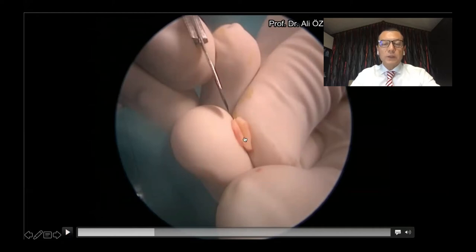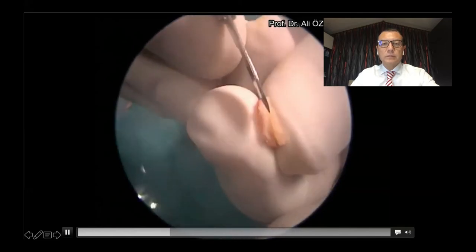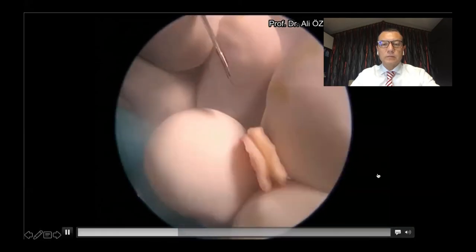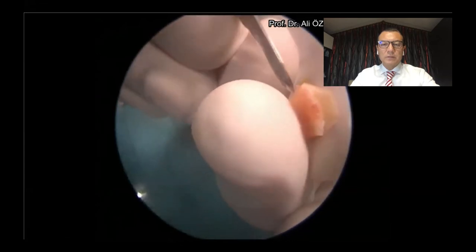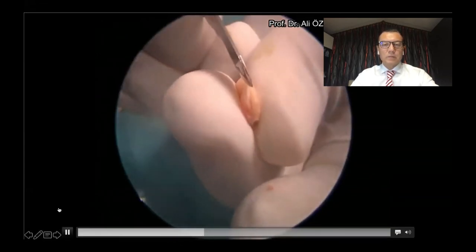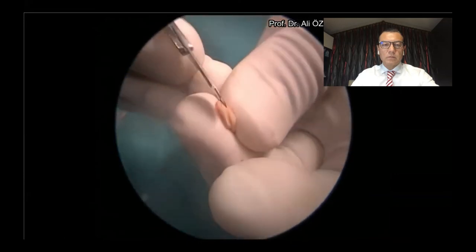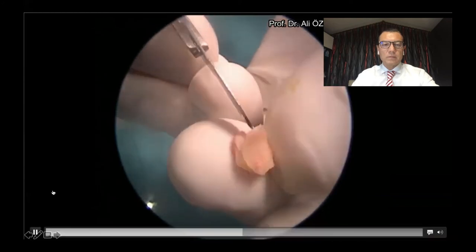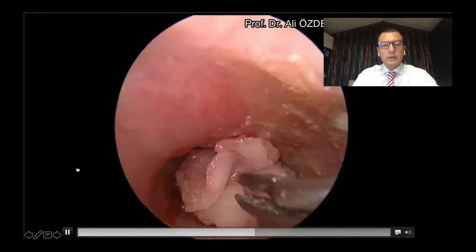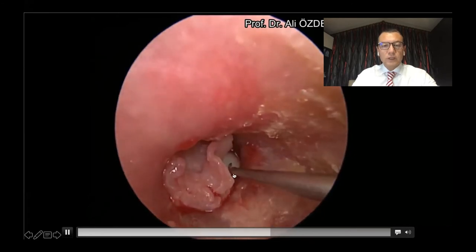And then we prepare our cartilage butterfly graft. We make a circumferential incision to the cartilage piece, giving it a dumbbell shape. And then we make a small notch to the inner part of the cartilage to fit the malleus.